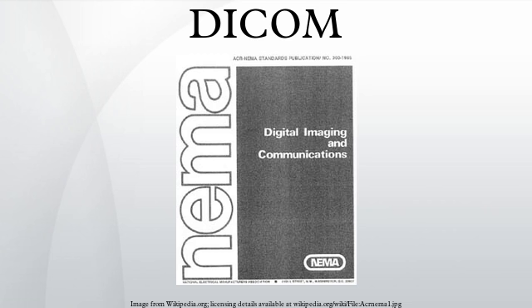Printing. The DICOM printing service is used to send images to a DICOM printer, normally to print an X-ray film. There is a standard calibration to help ensure consistency between various display devices, including hard copy printout. Offline media. The offline media files correspond to Part 10 of the DICOM standard. It describes how to store medical imaging information on removable media.